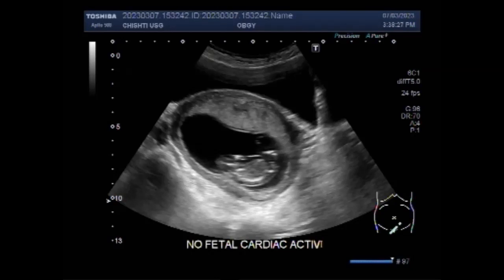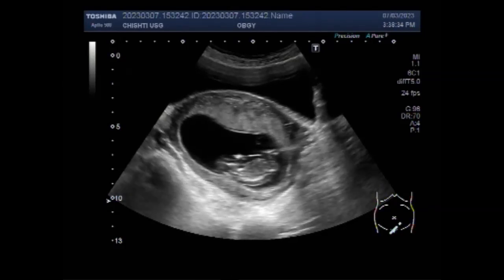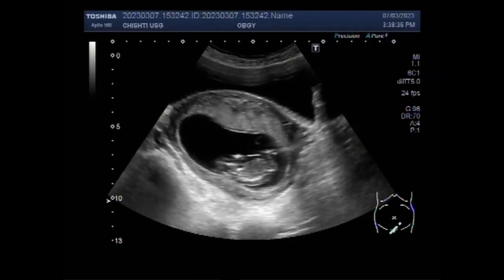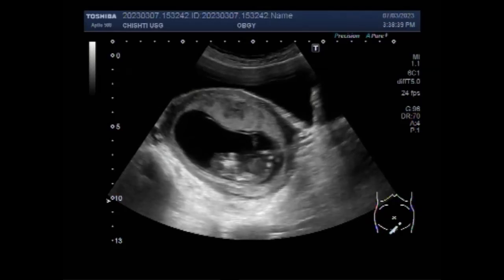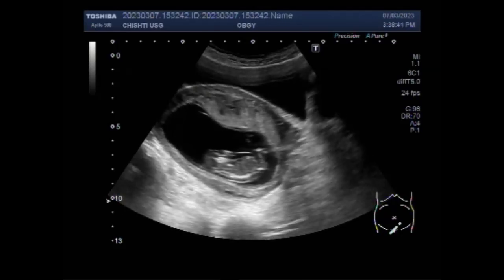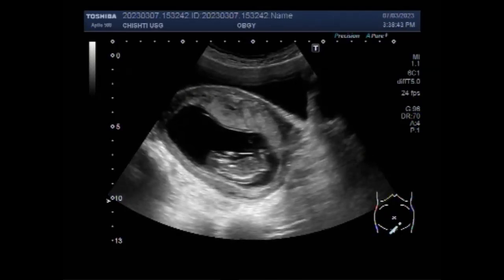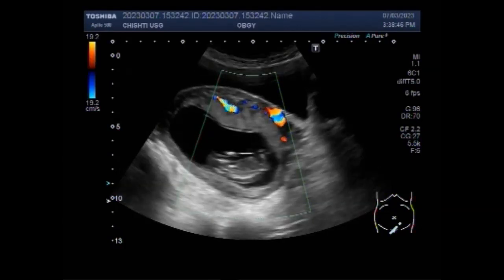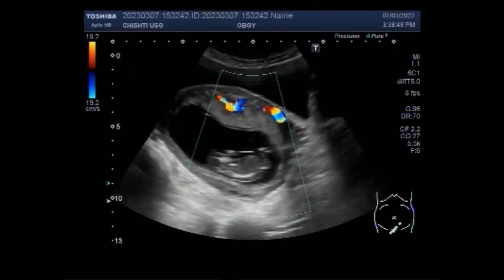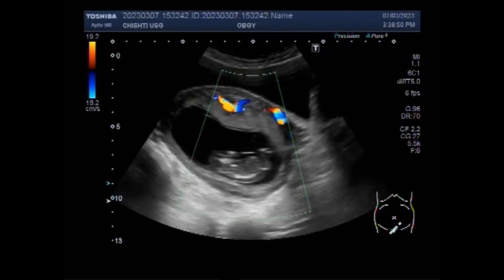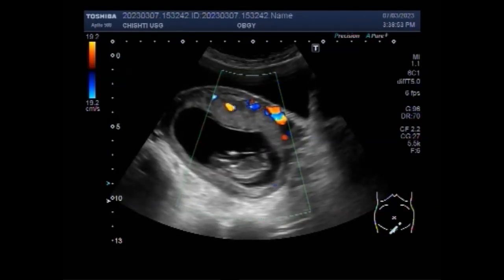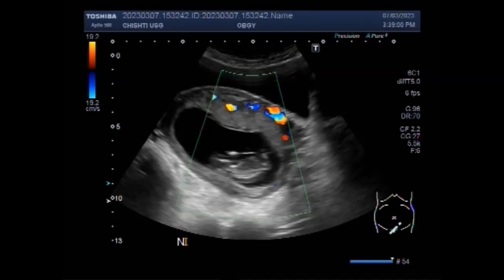You can see the fetus inside the gestational sac, but there are no fetal movements. At 11 and a half weeks of gestational age, fetal movements must be visible. But in this case, there are no fetal movements, and as you will see further in this video, there is no fetal cardiac activity and no blood flow is seen inside the gestational sac.